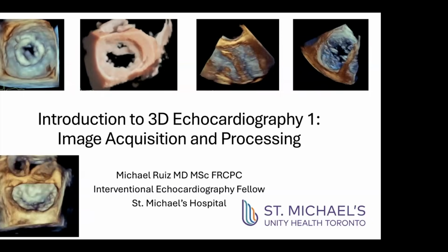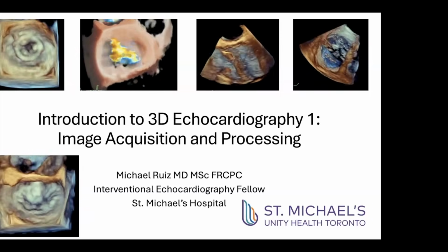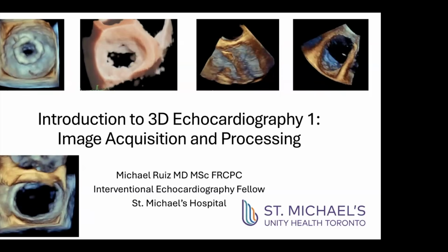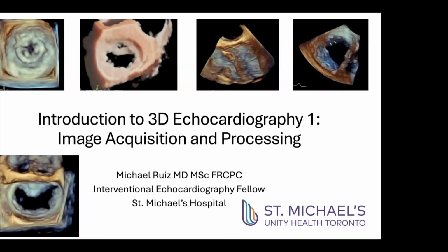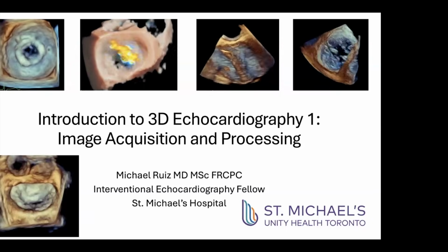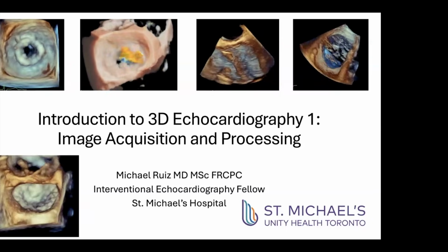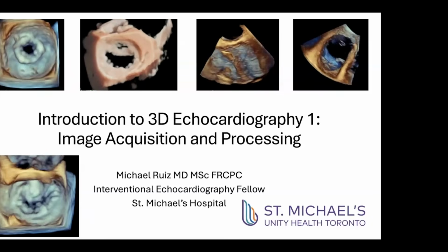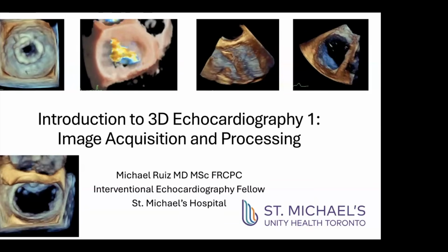I don't get to attend as much as I would like with our procedures being on Thursday, but I'm really happy to be here. Through 2 weeks in a row, we'll be doing our first talk today on the introduction to 3D Echo Part 1. Today we'll be talking about image acquisition and processing. And then next week, we'll talk about how to examine each valve and multiplanar reconstruction, to take things to a different level.